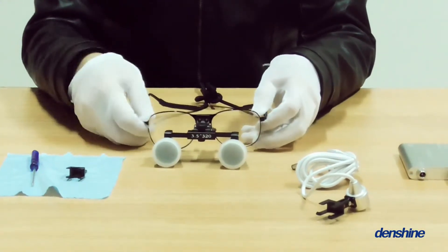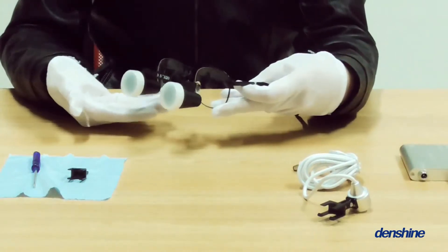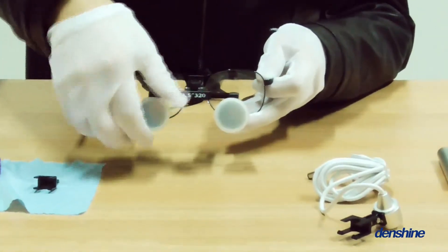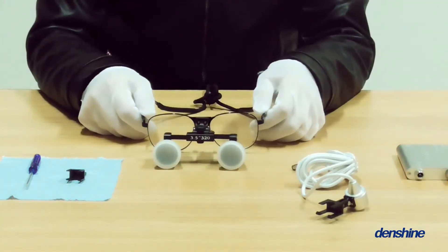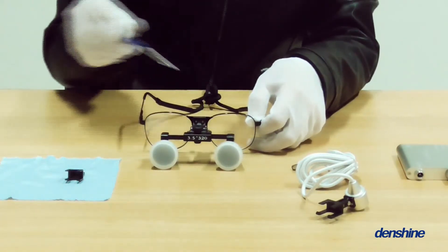Secondly, the package of dental loupes. Including: main glass, protective cups, cleaning cloth, screwdriver, flexible headband, and so on.